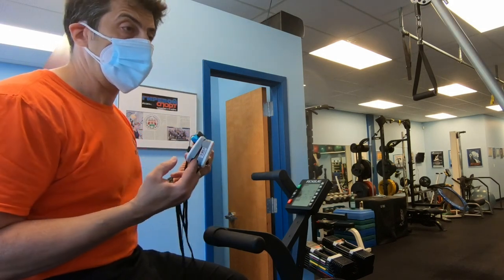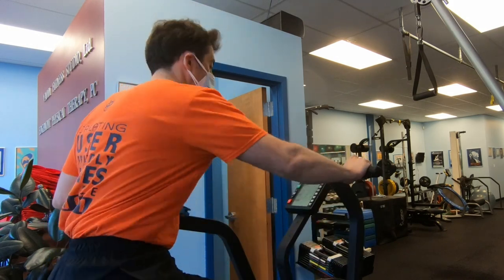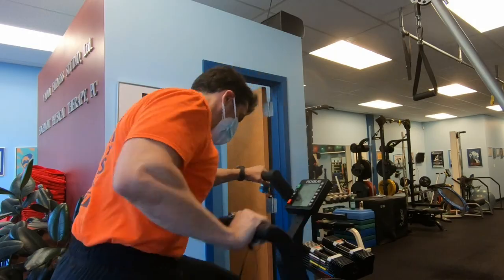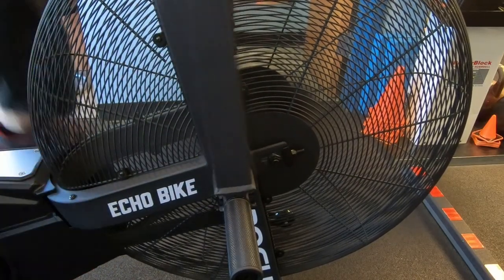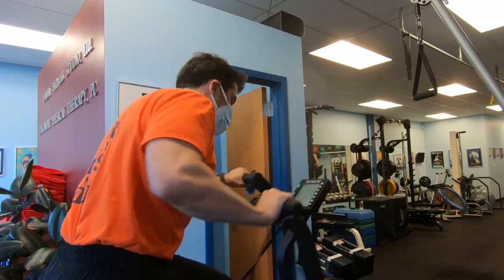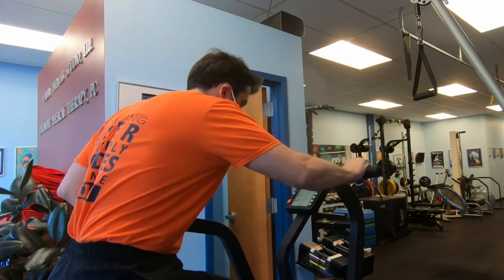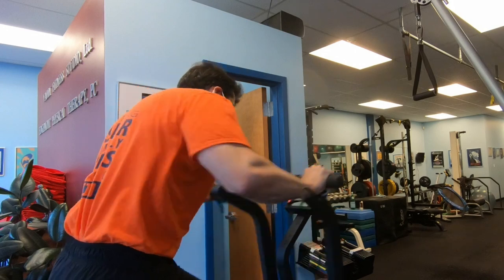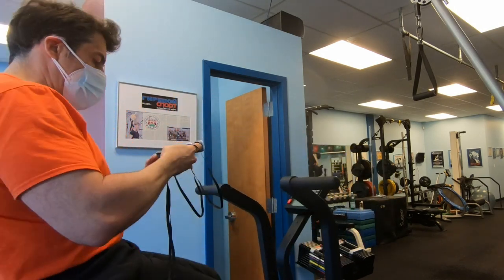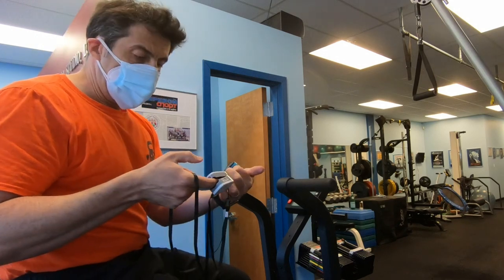And now I'm gonna go and do some exercise on the arm and leg bike for a few minutes to get my heart rate up and see if I lose some oxygen in my blood. Results. It's trying to catch up.